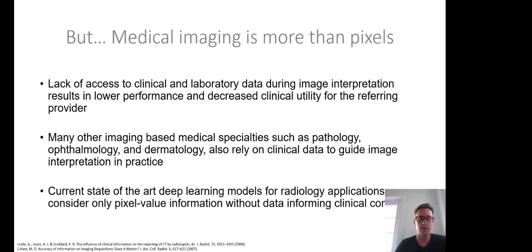But as I've just shown you, we can easily create state-of-the-art performance in a retrospective fashion for pixel-only tasks. And when you see these benchmarks that compare to human experts, that again is often done in a situation where the human expert also is not given the clinical context. And the challenge there is that you're actually creating an artificial environment that does not reflect real practice.